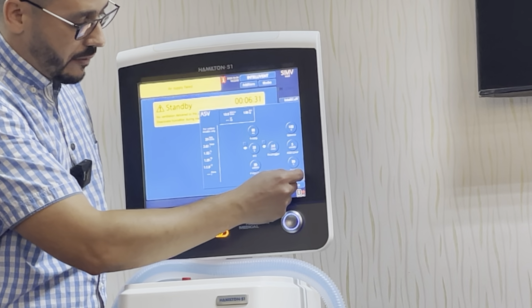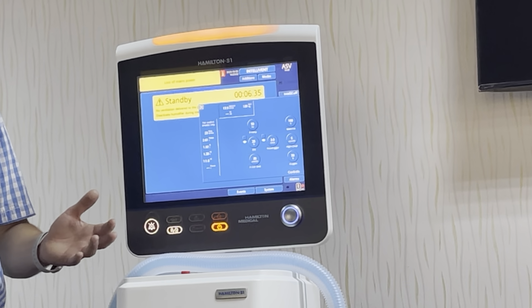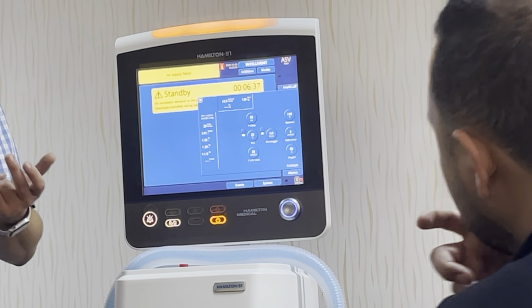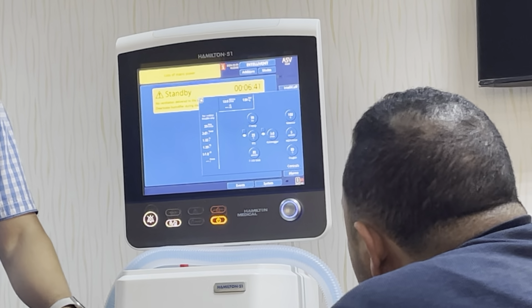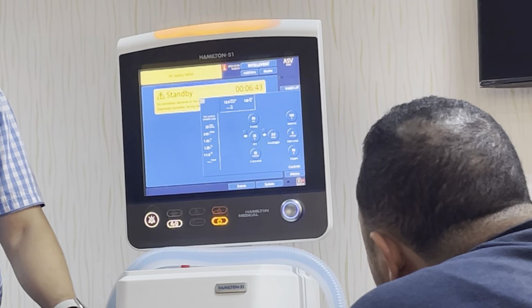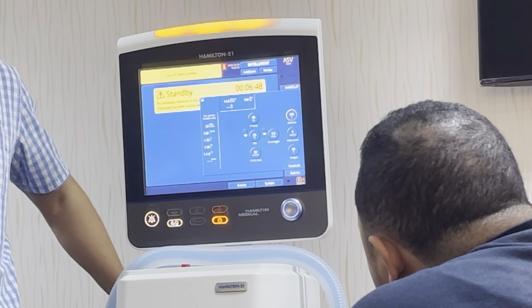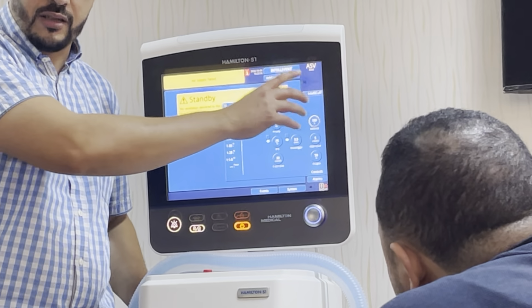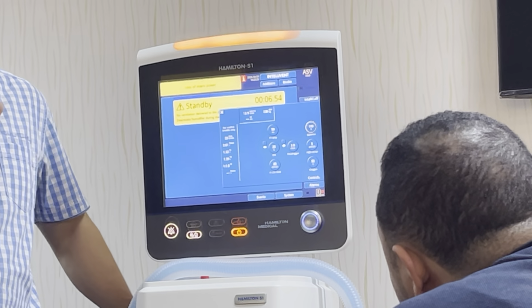Which parameter we have في ASV mode? We have all the parameters related to the ventilation اللي هما الريت والبريشر أو الفوليوم والريشيو، هذوما كلهم combined في one single parameter اللي هو minute ventilation percentage. هو هذا. تو ما عادش عندنا لا بي كنترول، لا عندنا تايدال فوليوم، لا عندنا ريت، لا عندنا ريشيو، لا انسبيريشن تايم، ولا عندنا one parameter.